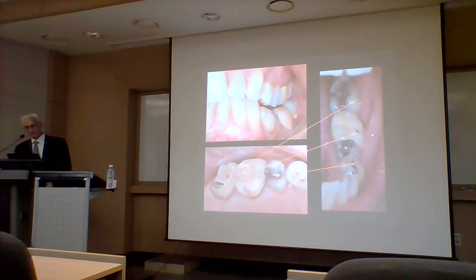So when we correct it, we can see visual space there, except maybe back here. And this is the kind of pattern that represents short disclusion. Almost no friction. A little bit there, a little bit here. 조정하고 나니까는 이제 부치부치 조금 닿는 거 말고는 라인을 보던 다 없어진 거를 확인할 수가 있고요. And you can see how they sort of line up to each other. This contact still needs to be removed. This is the guidance on the canine now, and that we would leave.